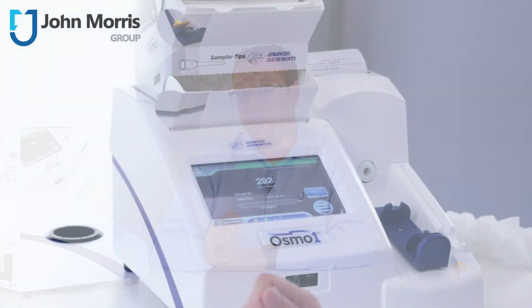It stores the last 1,000 test records and 10,000 events. You've got electronic data management for security and efficiency, bi-directional LIS via Ethernet connectivity, and the Osmo One provides statistical data analysis including mean, standard deviation, and coefficient of variation.